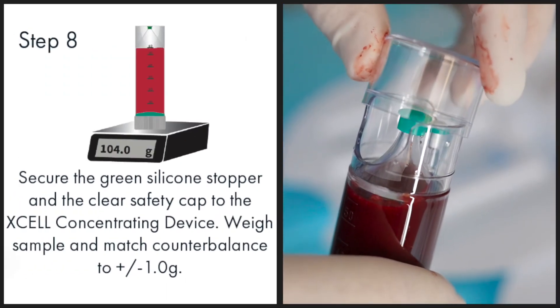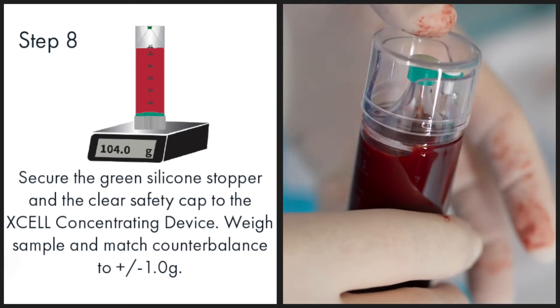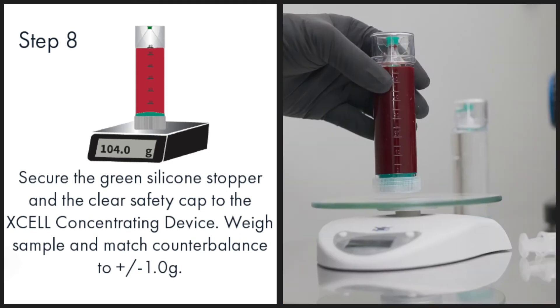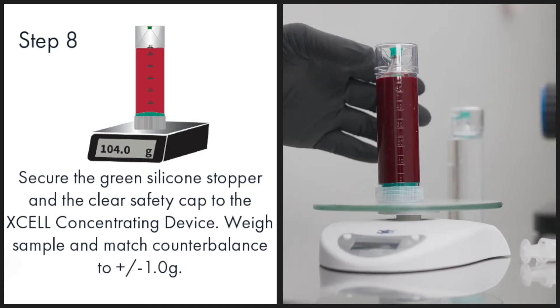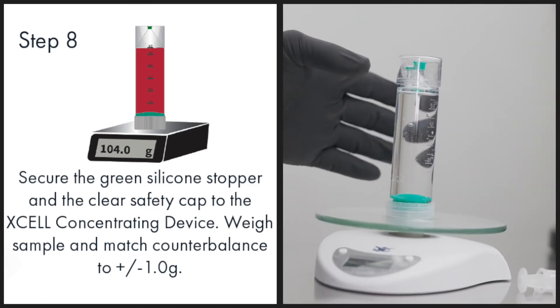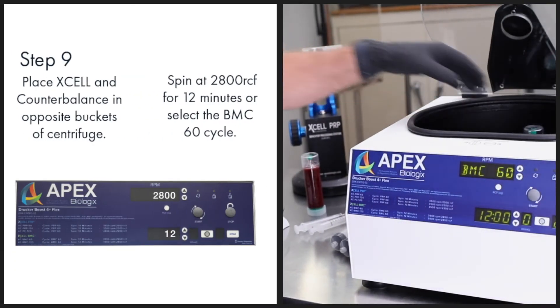Secure the green silicone stopper and the clear safety cap to the XL concentrating device. Weigh the sample and match the counterbalance within one gram. Place the XL concentrating device and counterbalance into opposite buckets on the centrifuge.